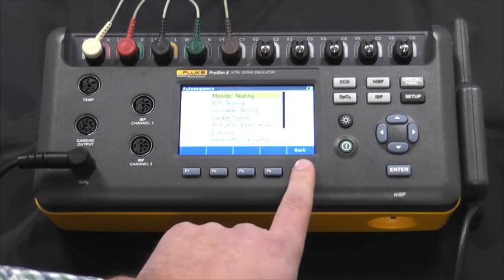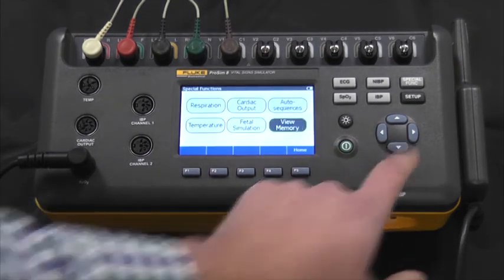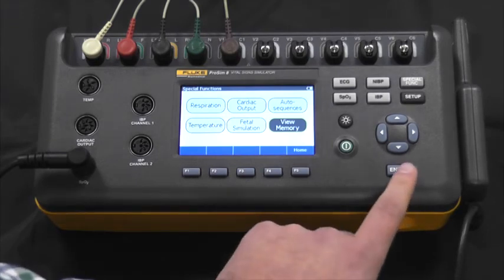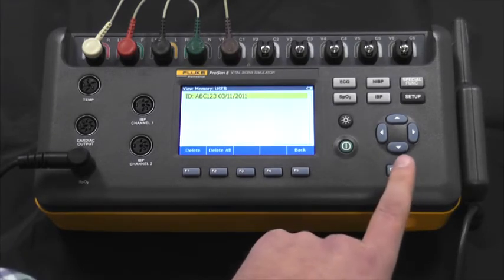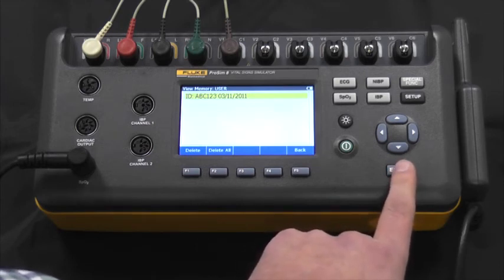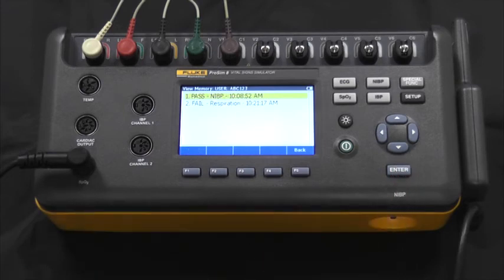You can also record them right then and there. You can also see that we have onboard memory. When you save those results, they will be saved on the onboard memory for you to observe at your desk after you've come back from a day of testing. You can see which tests passed and which tests failed.